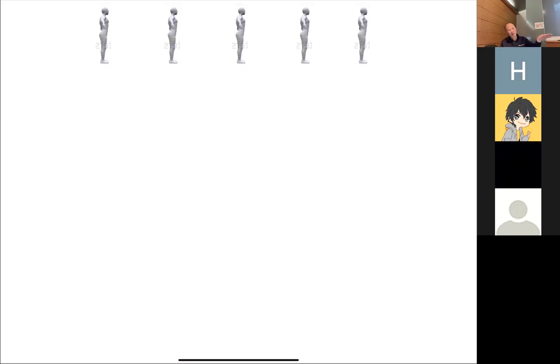And then the next thing we want to imagine is there's these 5 people and we put them in a gradient field where it's stronger on that side of the room versus this side of the room. Now the people on this side of the room are going to have a net clockwise rotation at every step, and the people on this side are going to have a net counterclockwise rotation. And the farther away they are from isocenter, the more rotation they're going to do at each step. So that's what we're going to show you in this graphic here.